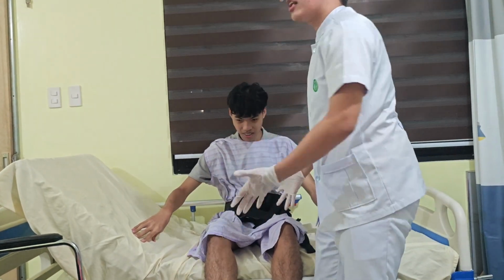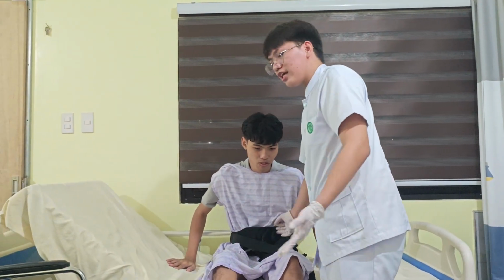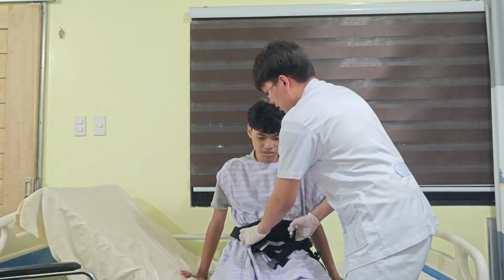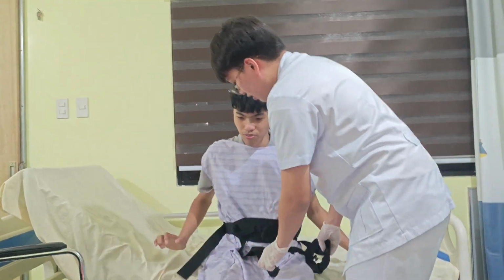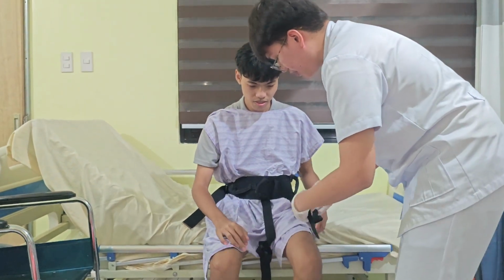After securing the gait belt, I'm going to ask the patient to move his buttocks to the edge of the bed. Okay, now let's carefully put these two on the patient's leg.